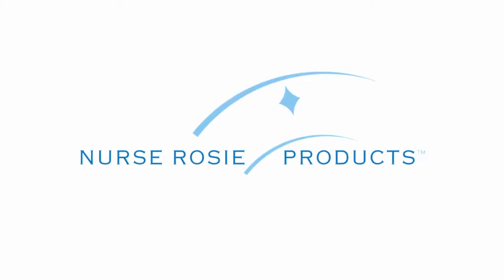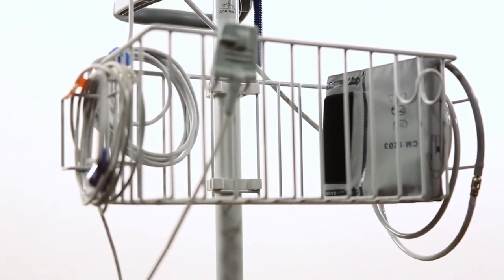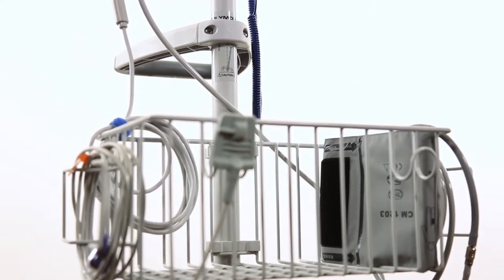Nurse Rosie Products is proud to announce the newest and most advanced member of our Vital Signs Equipment Team, Rosebud VC. The affordably priced Rosebud VC is an easy to transport unit that obtains blood pressure, pulse, SpO2, and temperature measurements in a matter of seconds.